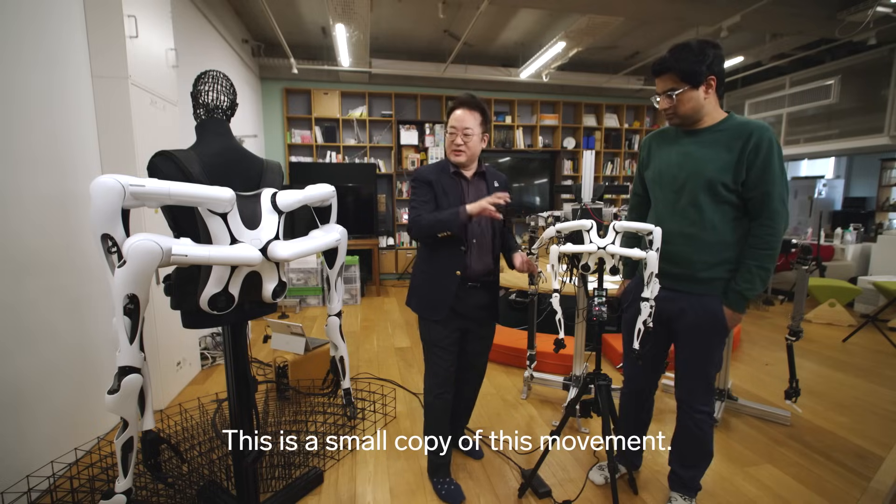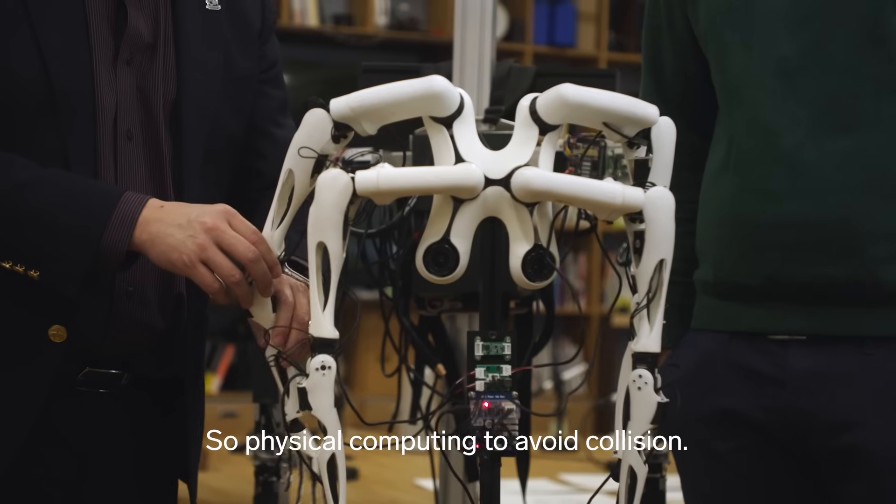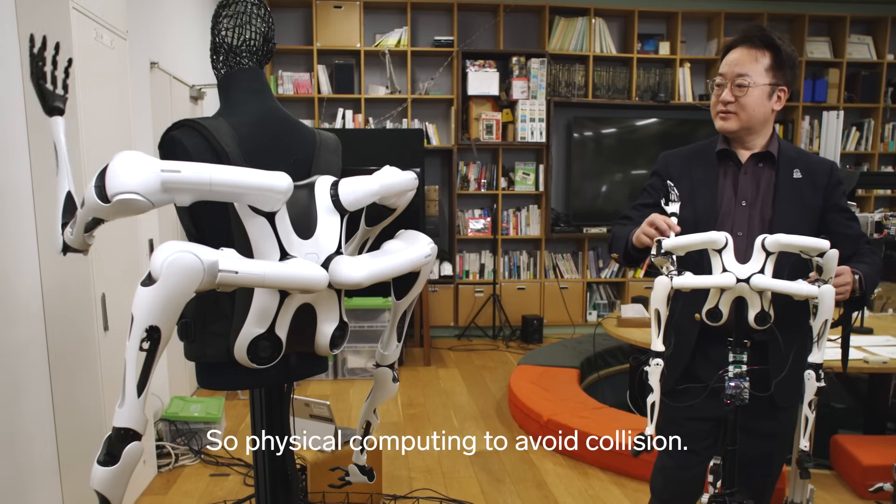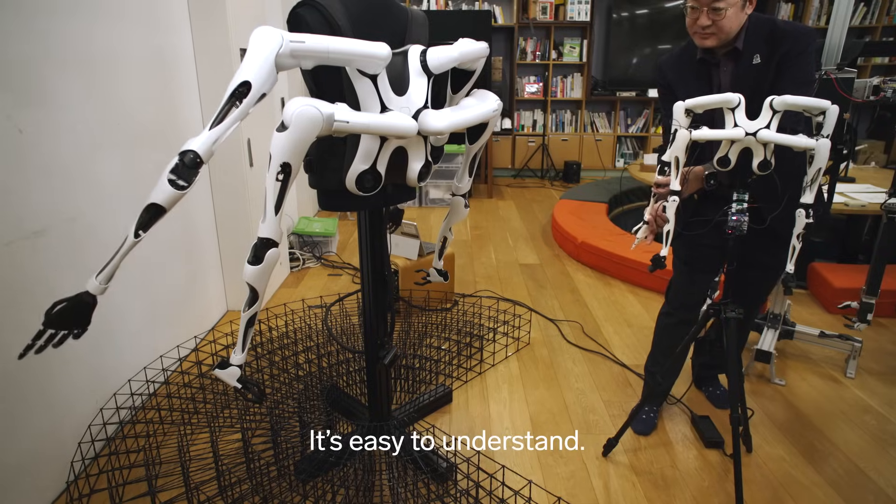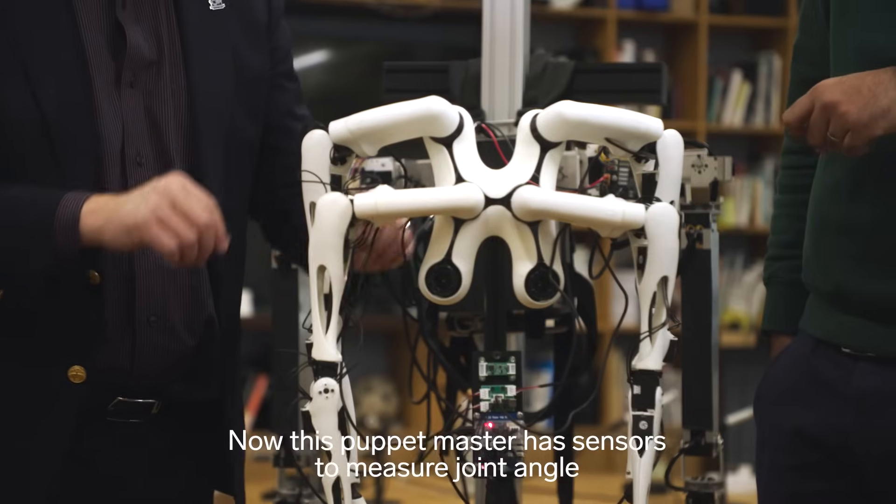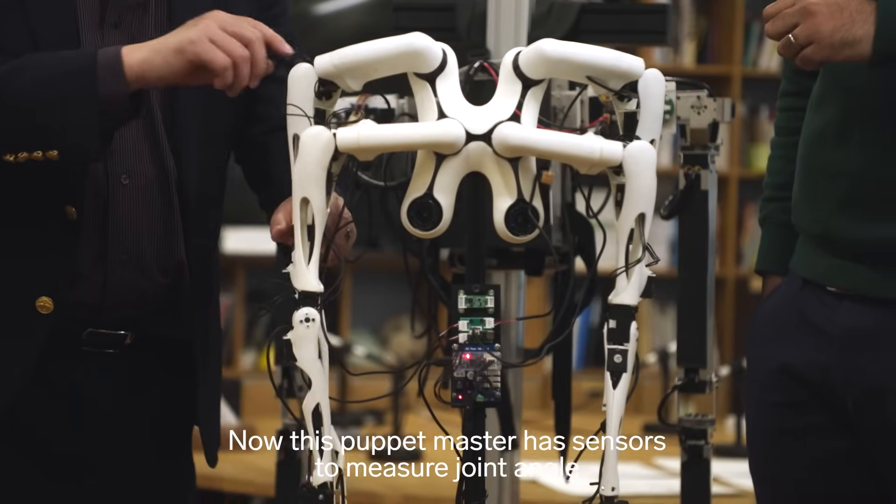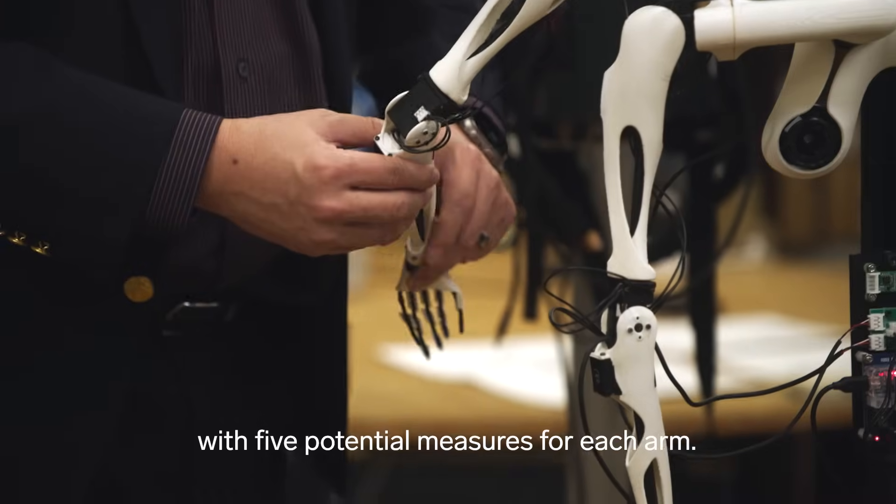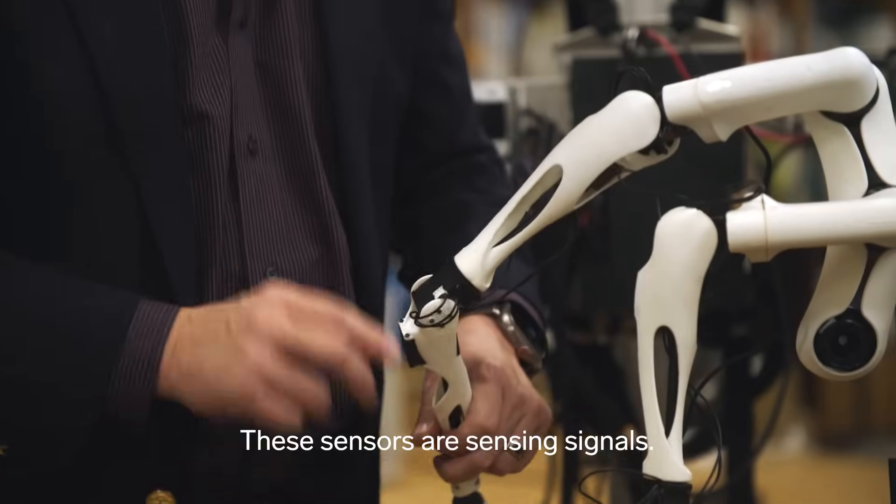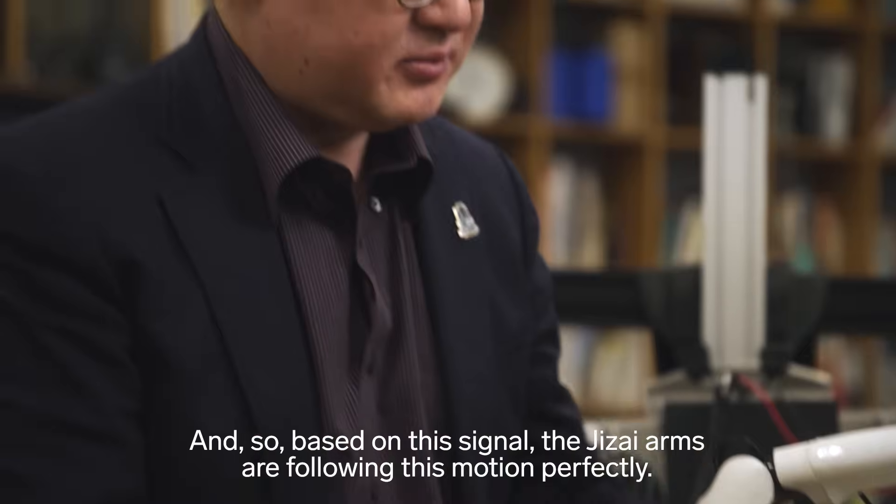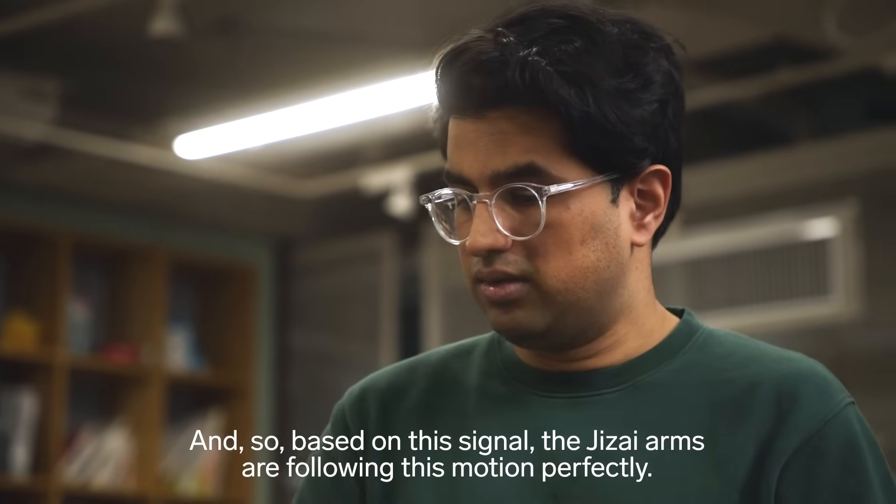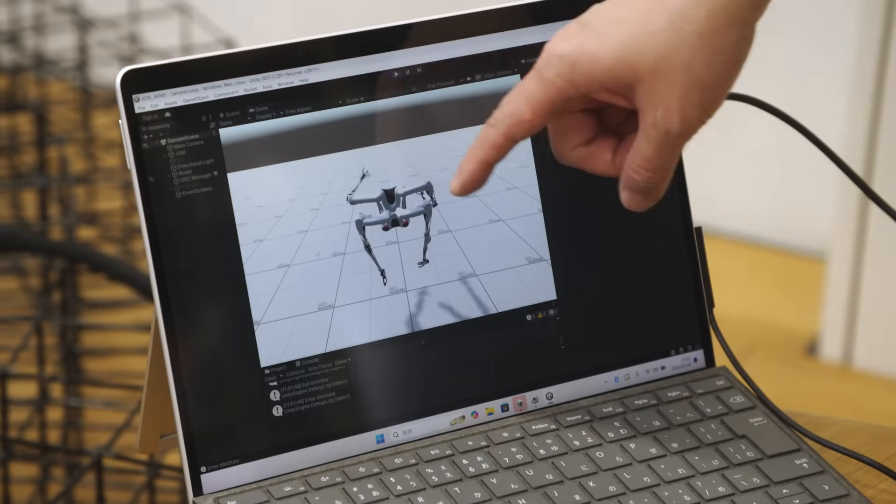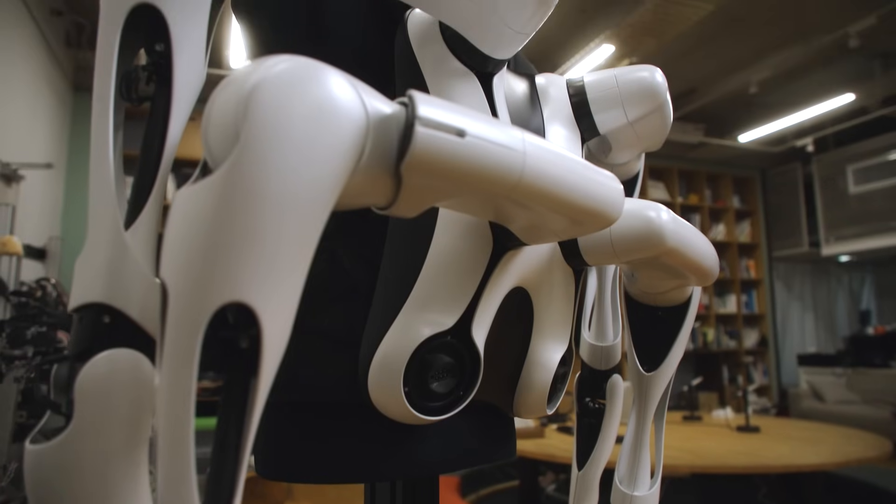This is a small copy of this movement. The physical computing to avoid the collision. It's very intuitive, easy to understand. This Puppet Master has sensors to measure joint angle of five potentiometers for each arm. This sensor is sensing signal, and based on this signal, the arms are following this motion perfectly. The sensors' data goes into the 3D model in the laptop, and then that controls the bigger arm.